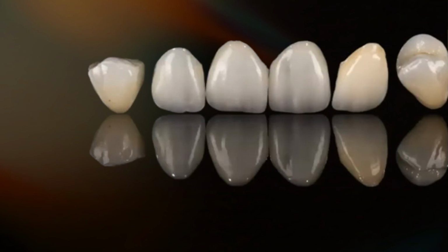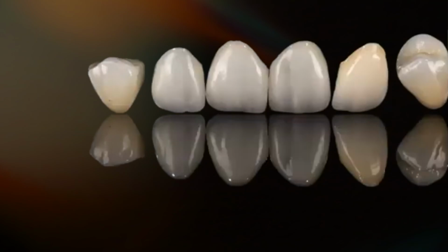Now, the best guy in the world to describe this and to teach this is for sure Paolo Cano, who has his technique of multiple layers and multiple stains. But just to put it simple, in this type of case, you can stain outside of the restoration, and in this case, because the restoration is more thick, you need to add chroma to it, because otherwise it's going to be more white than the other teeth. And also to block the dark coming from the substrate, you stain it inside to block the color.